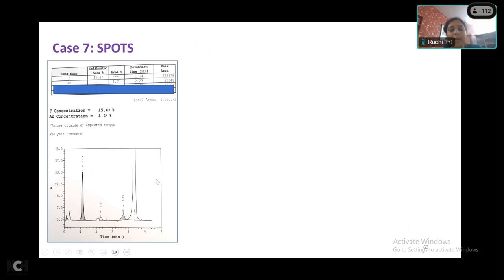So I have not shown one particular case spectrum, which Dr. Mukul had pulled me up for, that Dinesh and I had worked on. So what do you think this could be? Again, if you look at the plot, there is no normal HbA, right? The HbF is increased and then you have a peak after A2 which is a retention time of 4.39. So it is not E, right? And I tell you the patient is symptomatic, abdominal pain at maybe 7-8 years of age. Right, sickle cell, right?